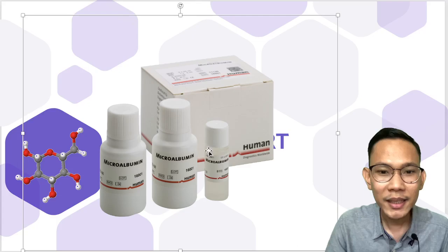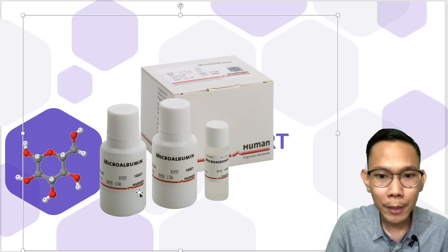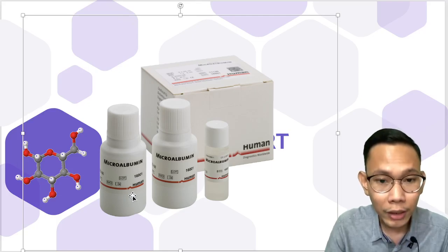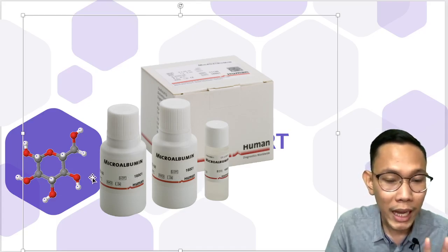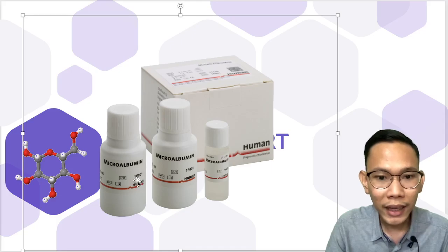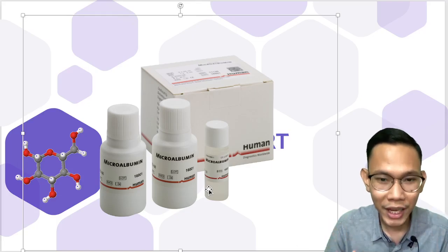It comes boxed, and there are things written on it. For example, STD, that's your standard, and RGT, that's your reagent. Sorry, there's nothing written here, but usually it's boxed and the lot numbers are written on it. So this is now your different reagents.